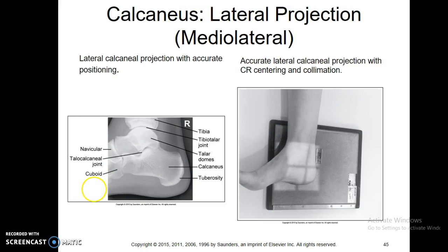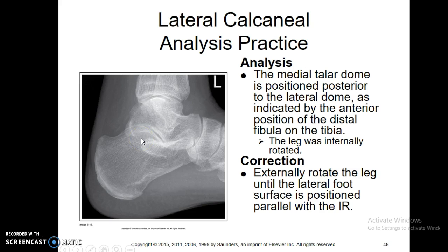Lateral, no real problems on that. Just make sure that you get the entire calcaneus on there. You can get a little bit of the tib fib on there, but not as much as you would on a regular foot series.